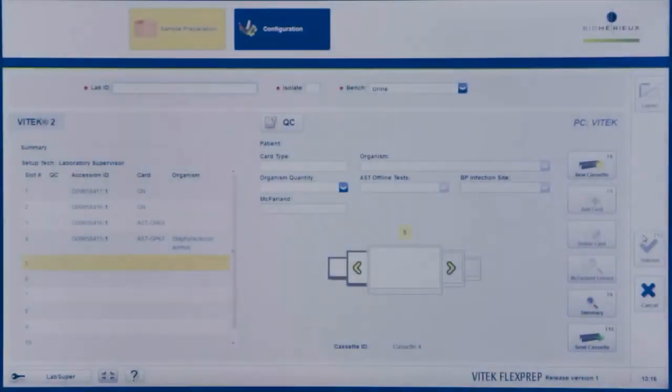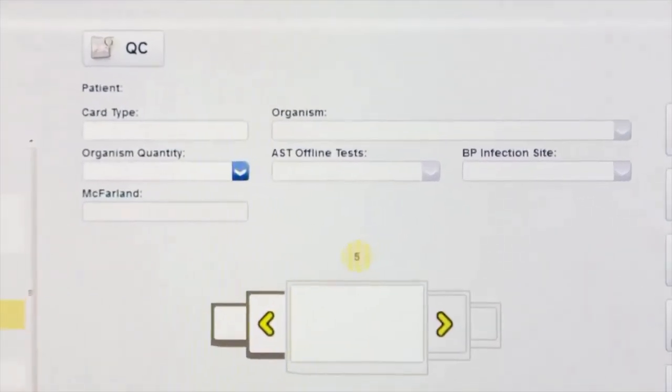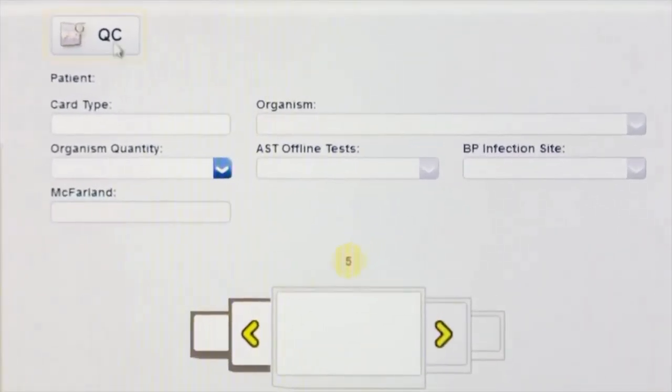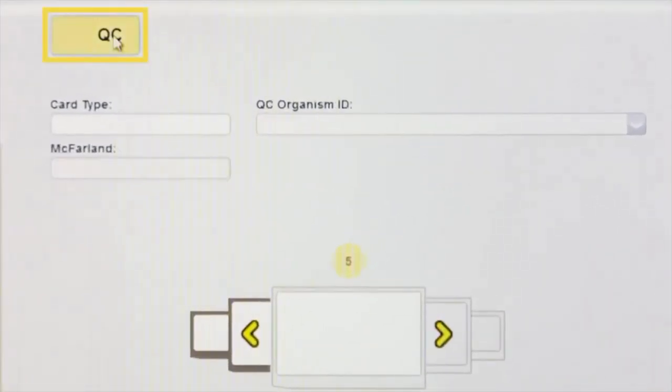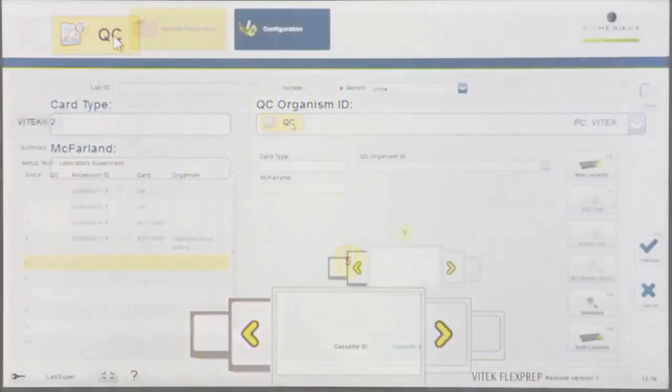To define a QC card, click the QC button. This will display the quality control screen which will contain a card type field, QC Organism ID field, and a McFarlane field.